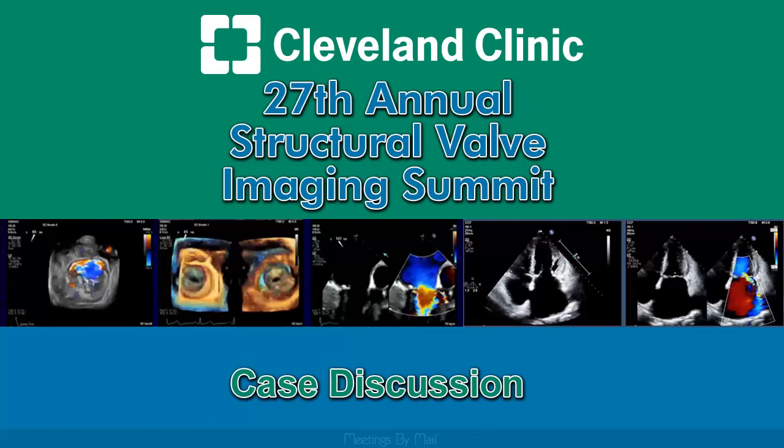So great case and great imaging. Just out of curiosity, she'd had a lot of aortic interventions over her lifetime. At the most recent, had there been any issue with her mitral valve at that time? Not that it was reported to us, no. Okay. But after her aortic valve surgery, she had some trivial to 1+ MR, and that just continued to keep progressing.